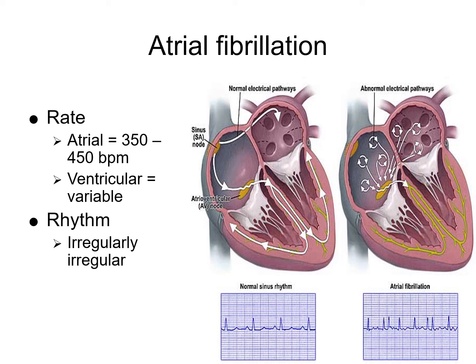So basically your atria are quivering. The atria have no pumping ability. The AV node will take over but cannot handle all the activity. It will allow random contractions to pass through in no particular order or rhythm. That's why the QRSs just pop up whenever they can. Cardiac output is reduced with the loss of the atrial kick since the atria are not really contracting.